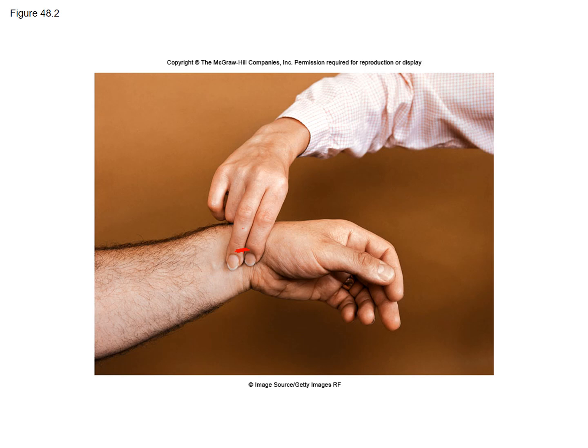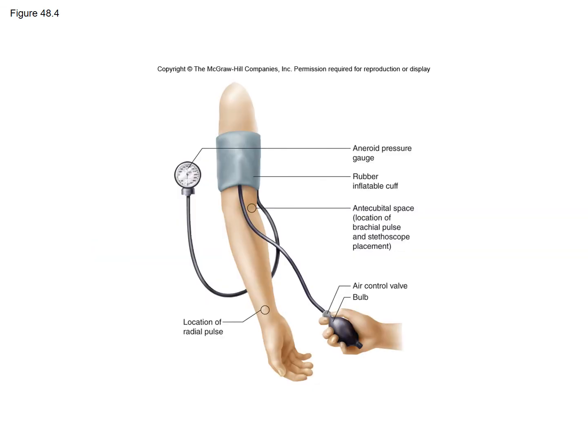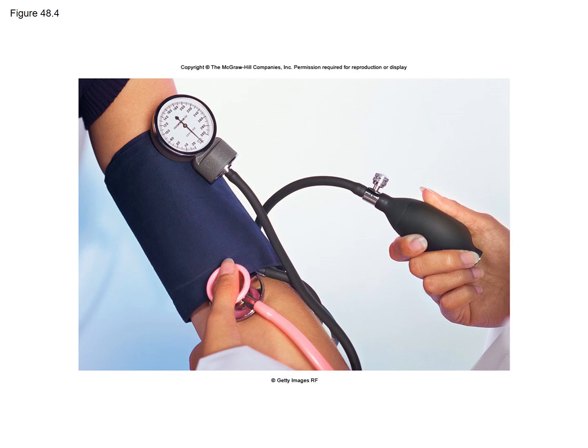It will probably be 70 something pulses per minute, from 68 to 77. Different, of course, if the person is an athlete or does exercise. And 120 is the first beat and the last beat you hear is 70, so the blood pressure will be 120/70.